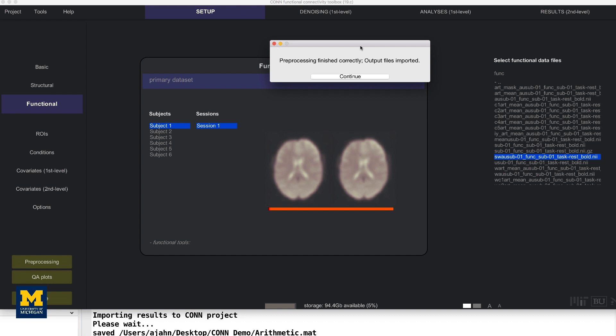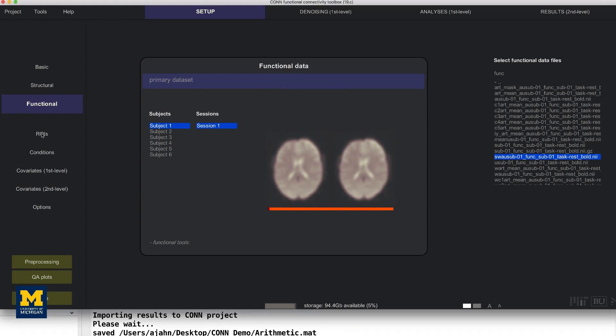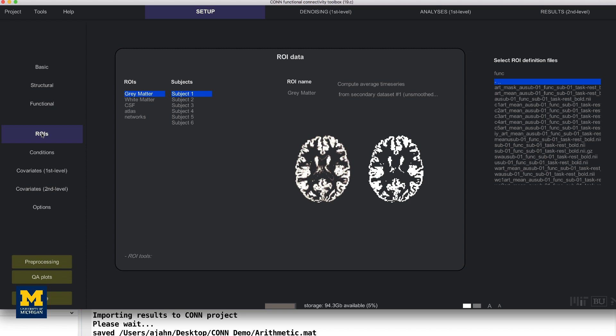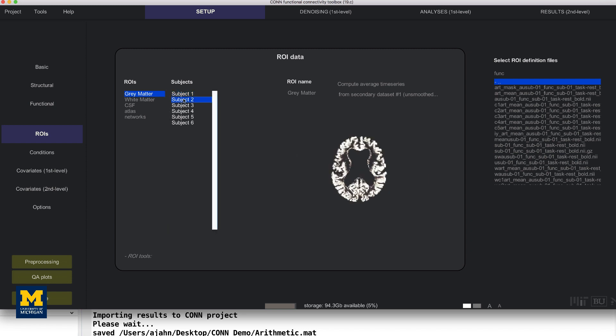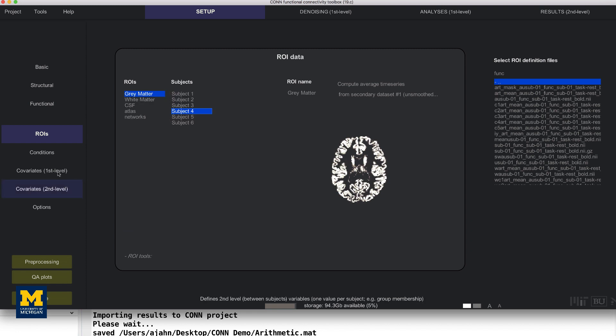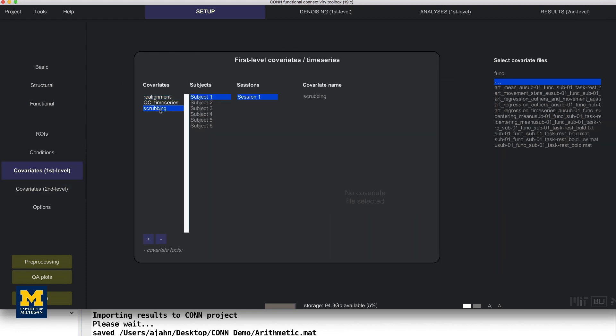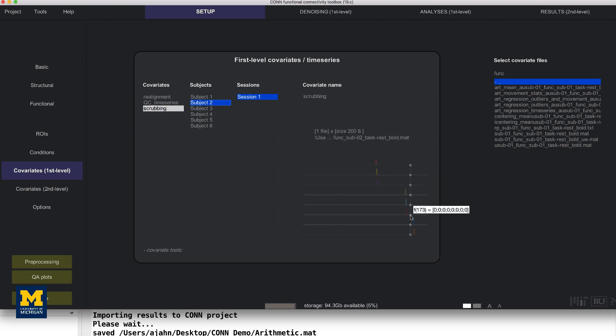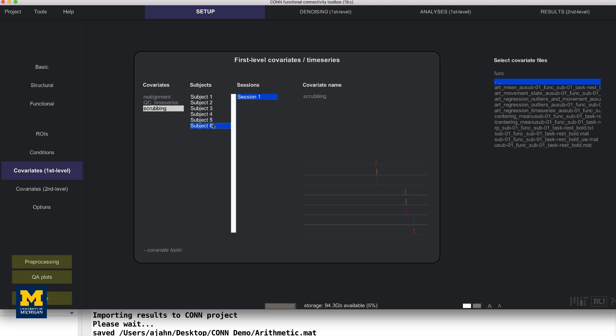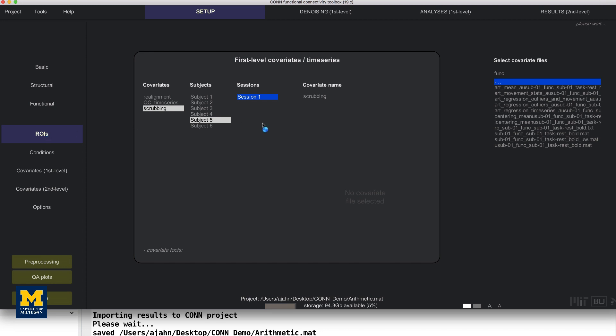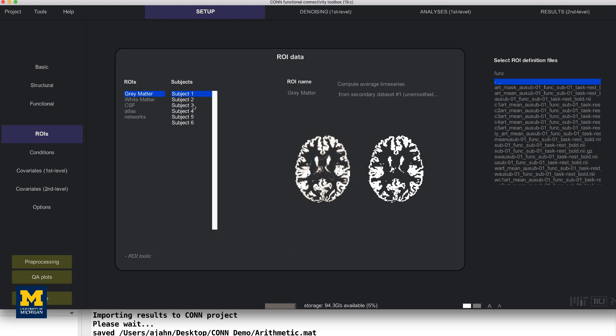When it has finished, check the ROIs and covariates first-level tabs, this time scrolling through each subject. Subject 2, for example, if we look at the scrubbing field, has 1, 2, 3, 4, 5, 6, 7, 8 volumes that have been marked as outliers. Each of these marked volumes will be inserted as a regressor into that subject's first-level design matrix. This is also called scrubbing, which removes their variance from the rest of the time series. I'm not going to go through all the subjects here, but just like we did with the first-level analysis, you should check each one to make sure that everything was segmented appropriately.